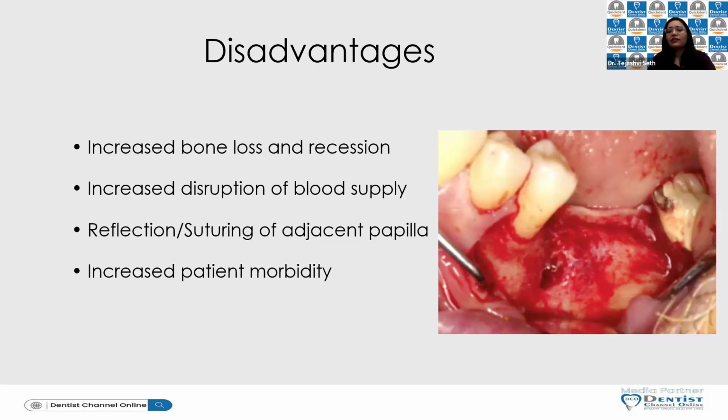And there's a lot of chance that your flap might necrose from the edges if you do this, but there's a way to go about it. You can keep the area moist. Have your saline irrigation. Don't let the tissue dry out. The more you keep it moist, the better the blood supply. It will retake the blood supply.